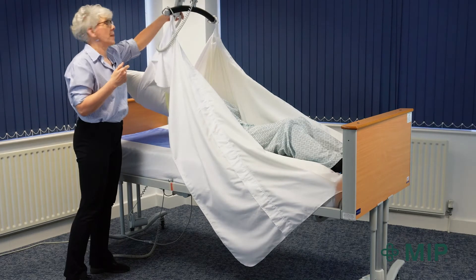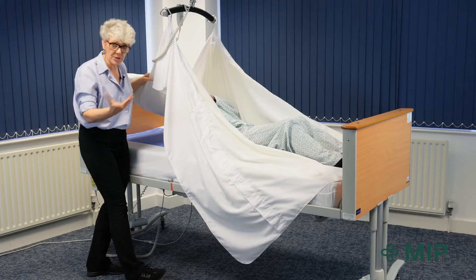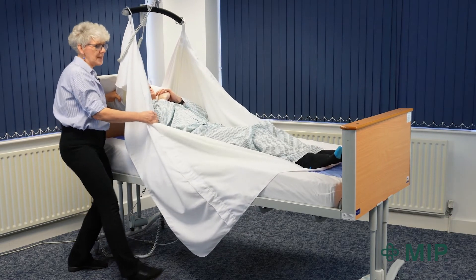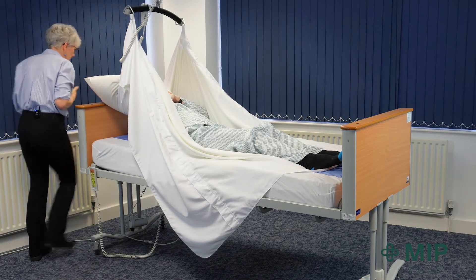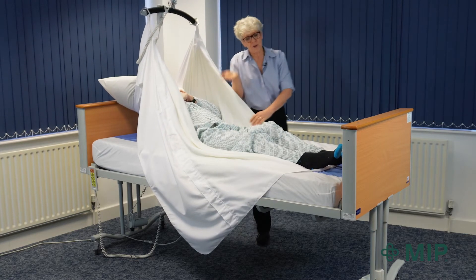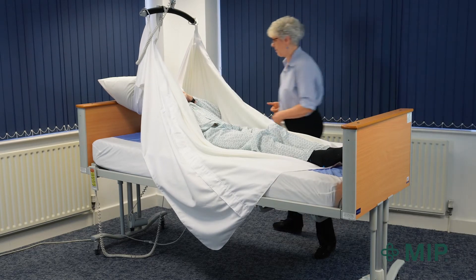This is just taking a bit of his weight to make it easier for me. At this point, hold the top sheet wherever it feels comfortable for you, and in my step stance all I'm going to do is move him up the bed. You'll see that he comes across the bed a little bit, so I'm also going to need to bring him back to the centre point. Because the hoist has taken his shoulders off the bed, it just makes it easier for me.